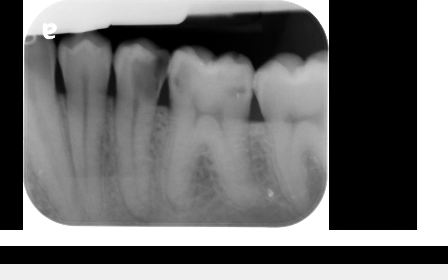Go ahead and take a look at this periapical radiograph. It's clear to all of us that there's a large carious lesion involving tooth number 20, not to mention there's a lesion involving number 19 as well as number 18. This is a large lesion which appears to extend into the pulpal chamber and the pulpal space, and possibly we are seeing a minimally widened PDL space at the apex.